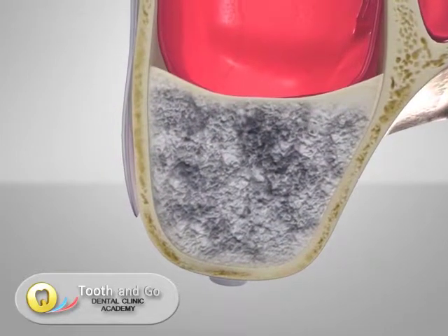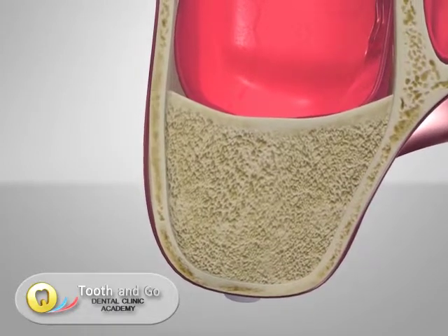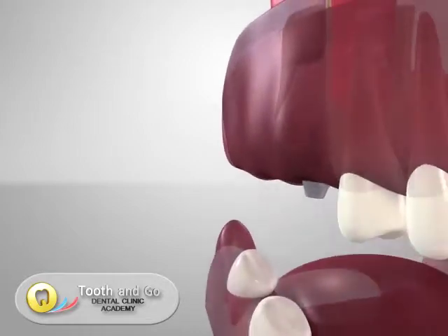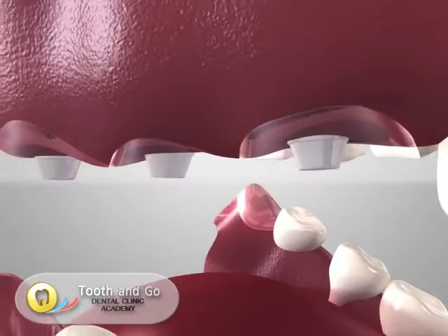Around 2 to 4 months after the placement of the implants, these implants will osseointegrate. Abutments and crowns can now be placed on the implants to complete the reconstructive work.